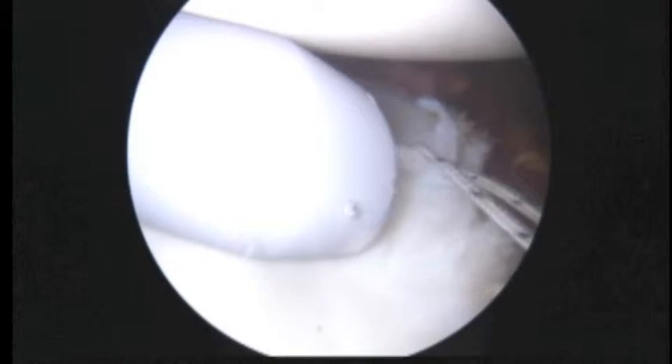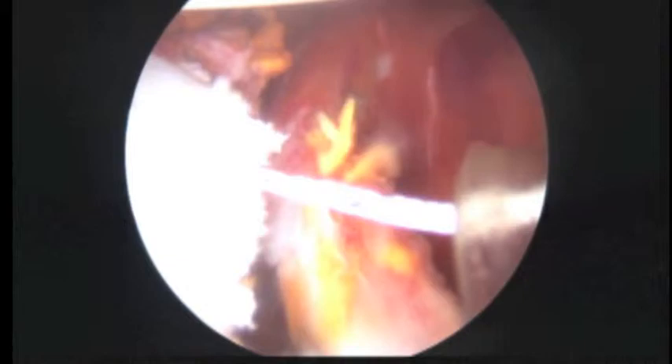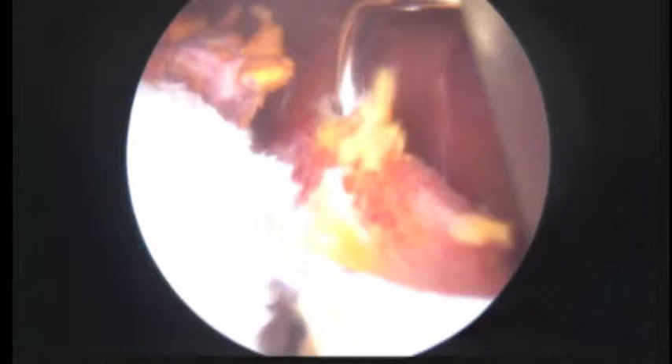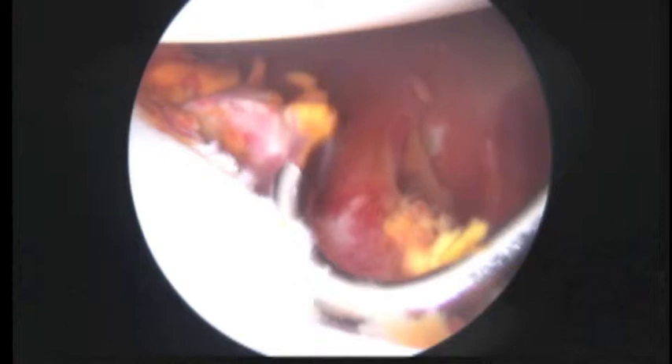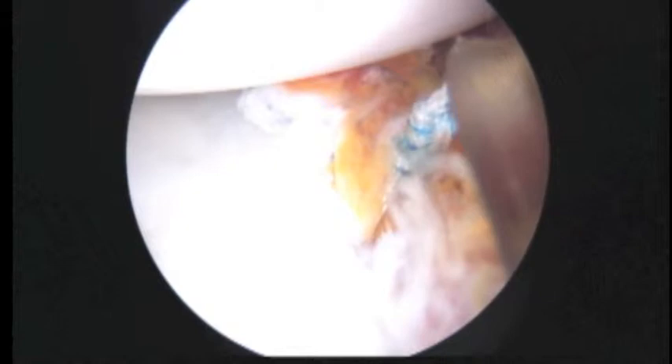Now we're ready to make our pass. We'll take a turn-to-the-left suture hook, which will come through the yellow cannula on the right side of the screen. I'm going to try and get way down here now. So we've got three implants and four sutures holding this all together.